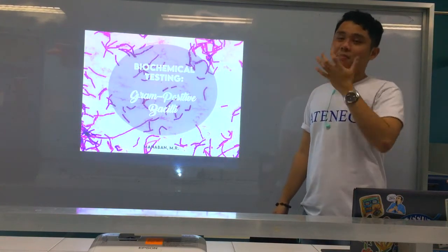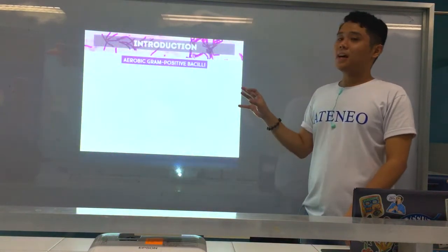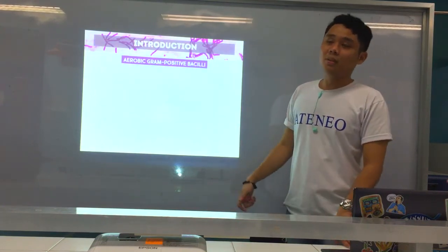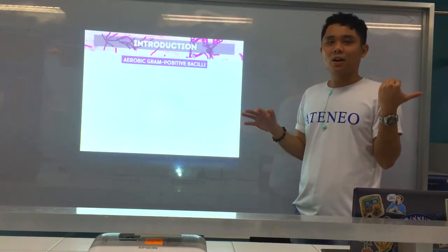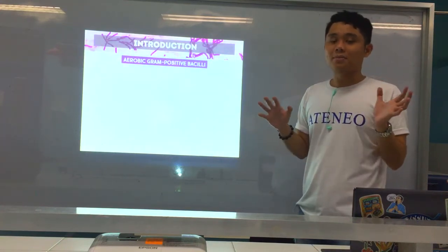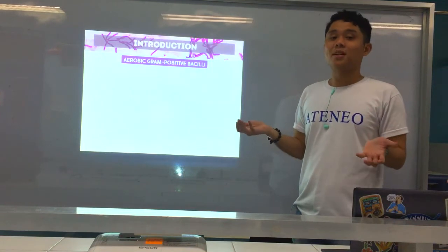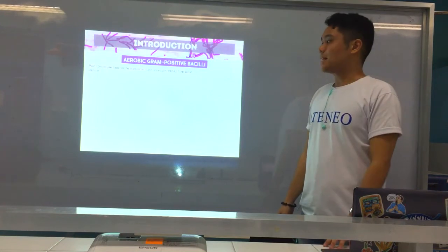The gram-positive rods or bacilli. What we're focusing on here usually is aerobic gram-positive bacilli, because there are gram-positive bacilli that are anaerobic. Which one is that? Of course, Clostridium. Anaerobes, like Veillonella among the gram-negative cocci, are discussed as one group regardless of their gram-stain reaction and morphology. I won't touch Clostridium for now because it would take time, since there are a lot of tests for Clostridium. For now, we're going to discuss your aerobic gram-positive bacilli.